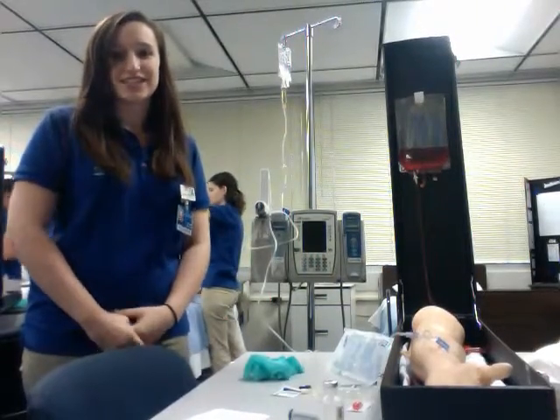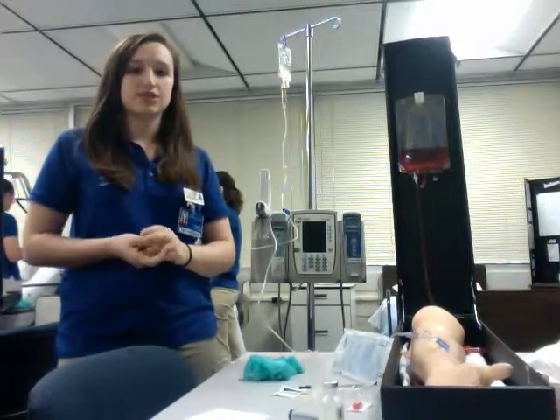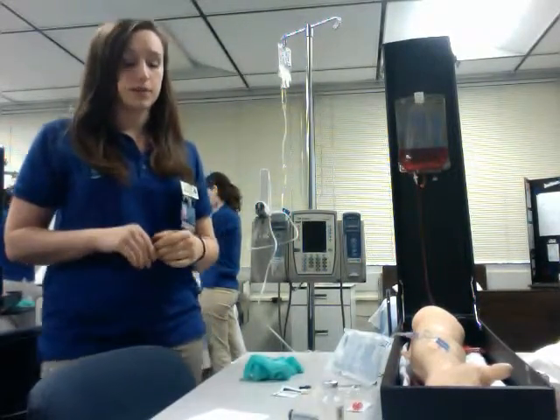Hi, my name is Chelsea Anich. I'm an FCJ nursing student. I'm in term 2 in section 5. Today I'm going to be hanging an IV medication via piggyback.